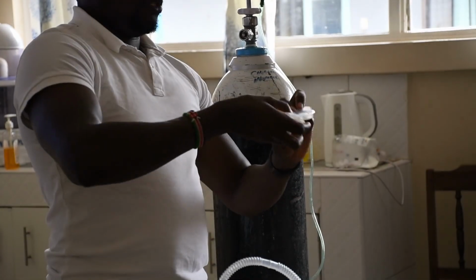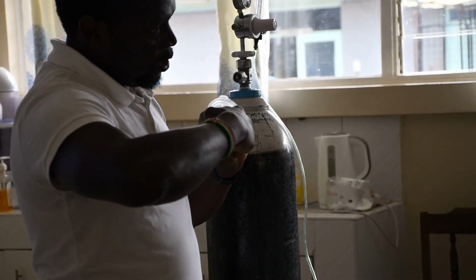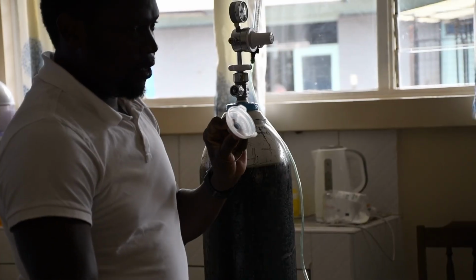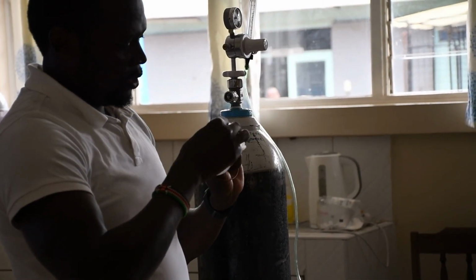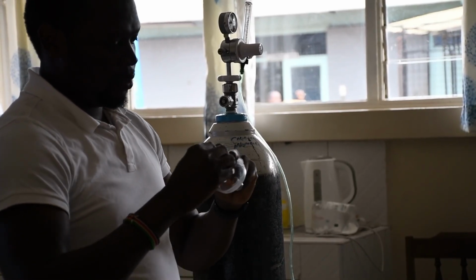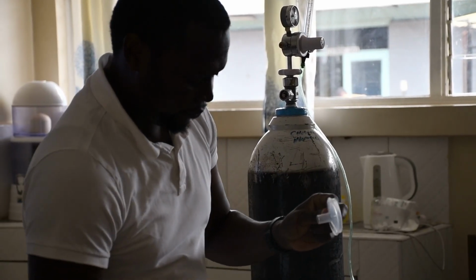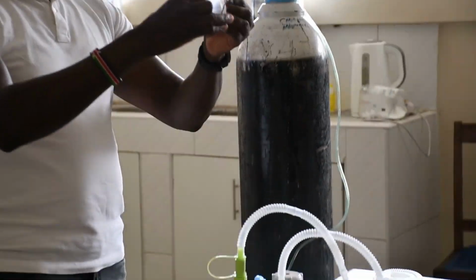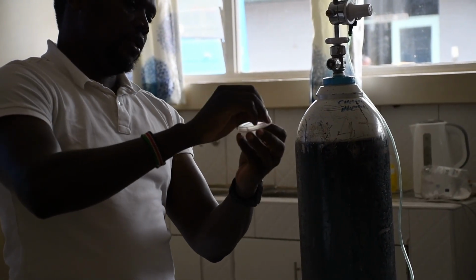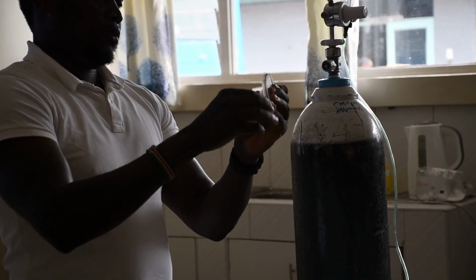So what you have here is, if you look at this, there are two housings. One is written "insert the filter disc here." Okay? So that's where the filter disc comes and rests. Okay? If you try the other way, it doesn't fit. So it fits there. The ring comes to the second part, and the second part has a grooving on it. Okay? So you want it to land in that particular grooving. Okay?